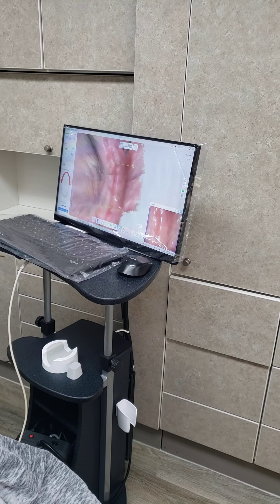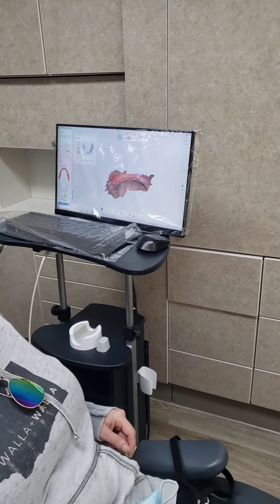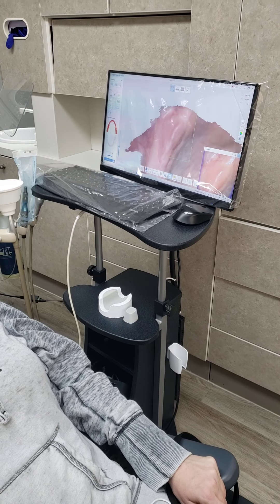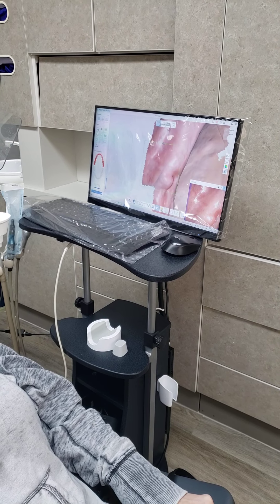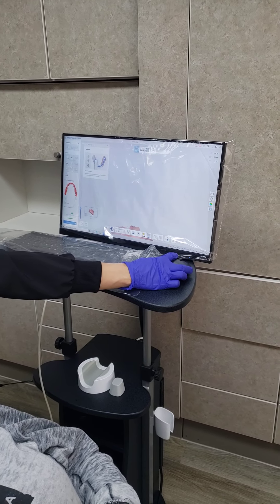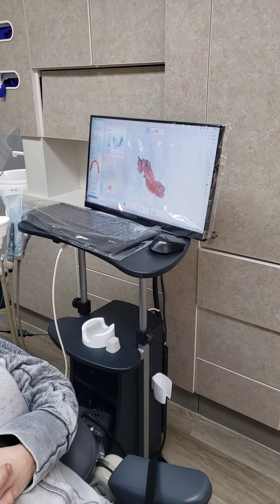Back here? You don't see the back? Yeah. What about her? Central? Oh, look at how cool that is — so awesome, so fancy. I'll tell you what, it's a hell of a lot better than all that gunk they used to put in your mouth.